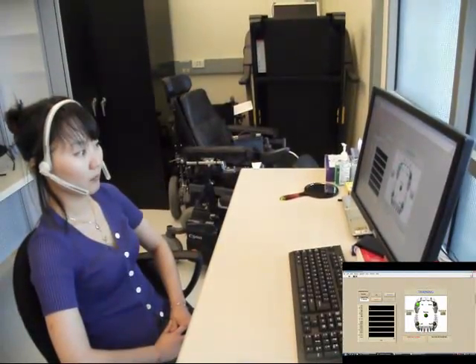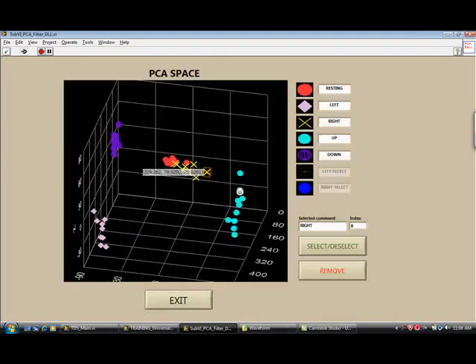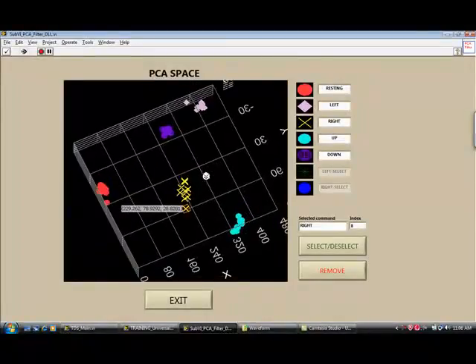Before using the tongue drive system, Zhanghi needs to train it by moving her tongue to each of the command positions ten times in a row. Different positions are indicated by green lights, and the computer registers and learns each position. The well-separated clusters of dots show that her training results are very good.